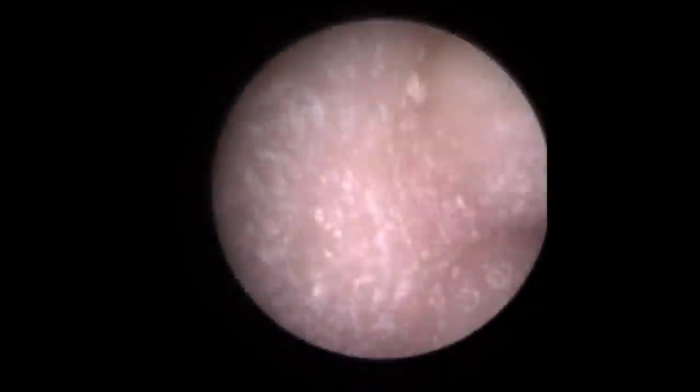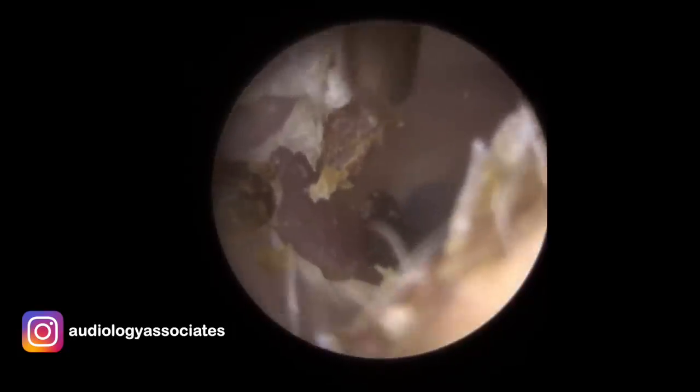So we're just going to take away some of these little dry skin pieces — with long strips like that it tends to whistle a bit when you get a hold of it with suction, so it doesn't come away straight away. I tend to go in and use the crocodile forceps to detach it. Because of the type of condition this patient has, you're not going to be able to remove all this dry skin — unfortunately it's just going to keep forming all the time. So we're just getting a grip on this top section and taking that away, just lifting that off the canal.